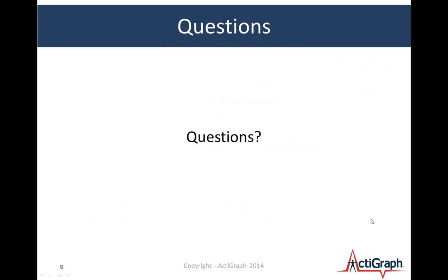So I thought it'd be a good time to pause here and see if there are any questions up to this point with regard to the terminology or sort of using proximity. And I don't want to get into too many detailed questions right now, just high-level questions, because I may answer what you're thinking in the next section here. But if there's any questions about the terminology or configuration, I'd be happy to take those questions now.